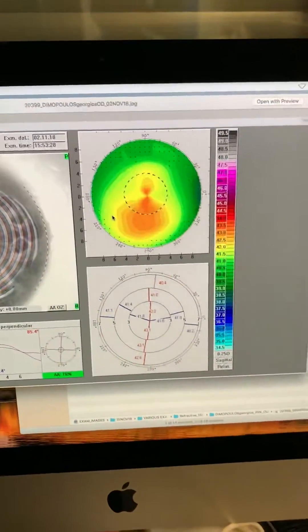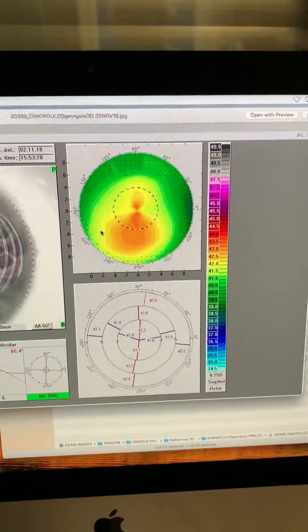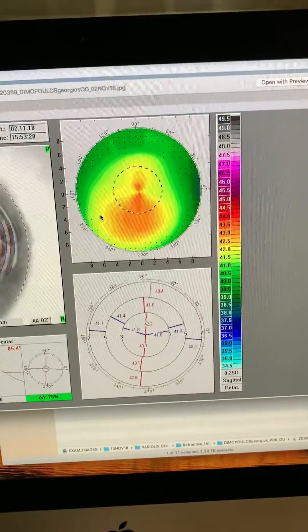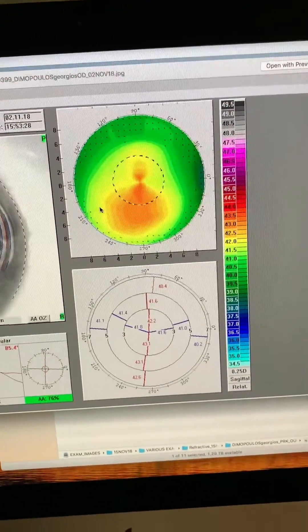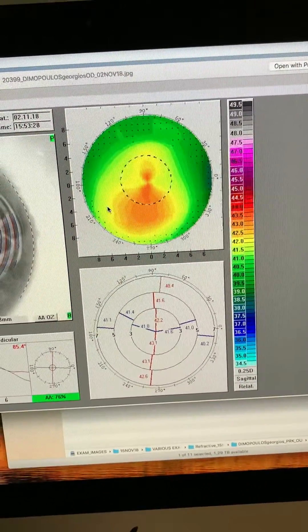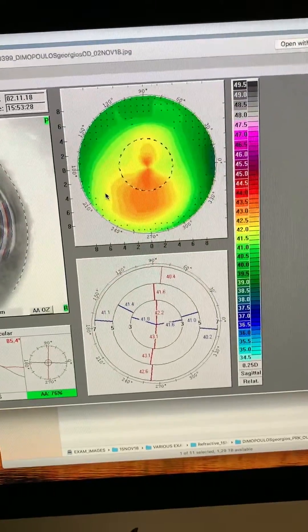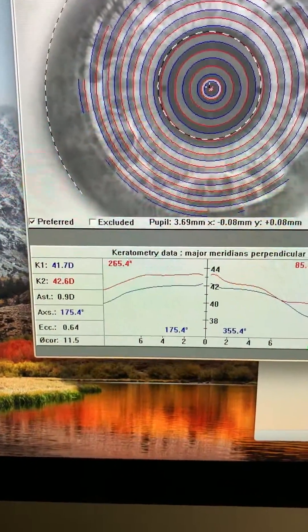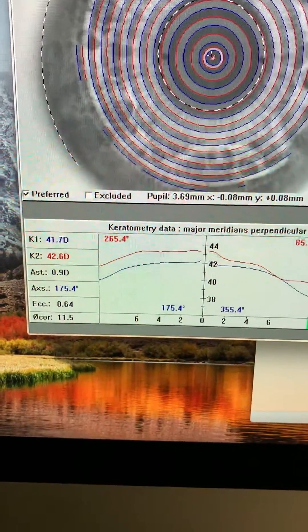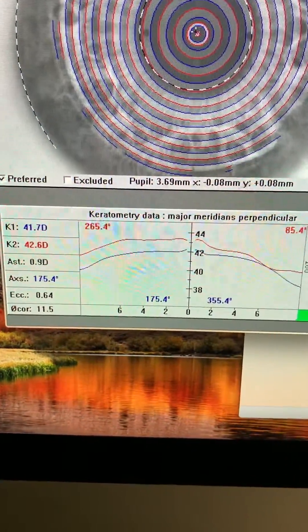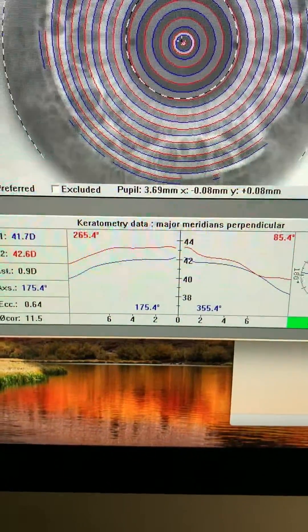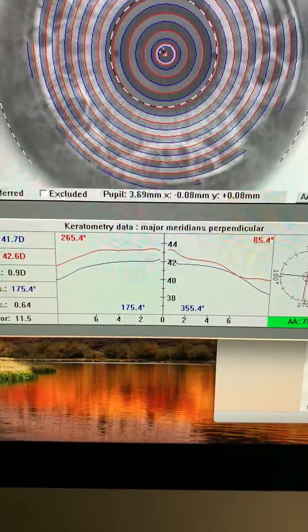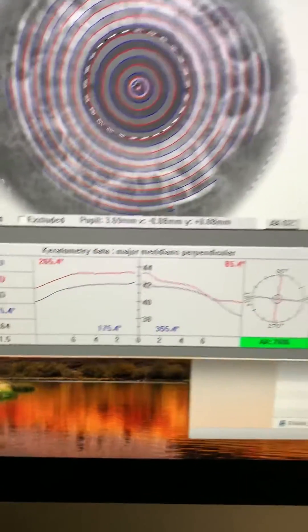I'm from our OR here in Athens, Greece. This is a young gentleman with a little bit of irregular astigmatism. He measures about 0.9 at 175 degrees. His topography-guided gives us one diopter at 175 degrees. His refraction is at 172 degrees and 0.75.